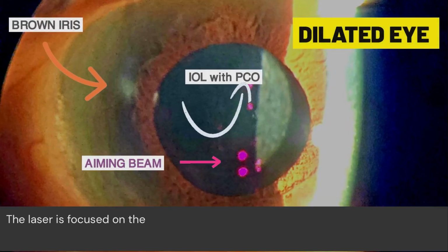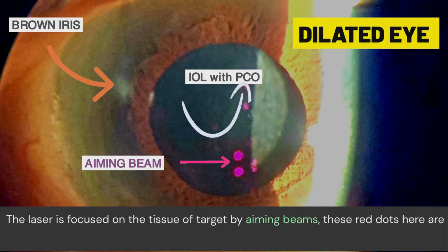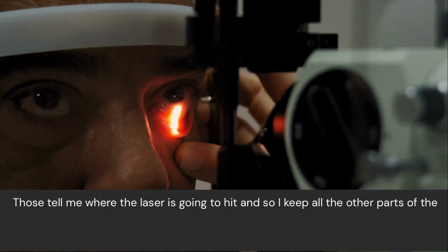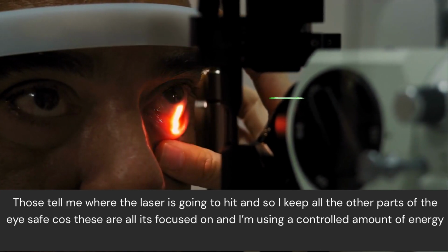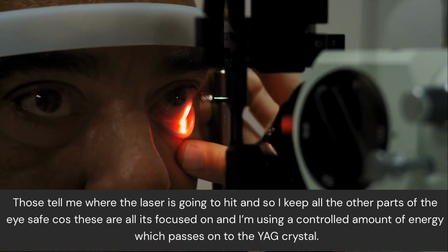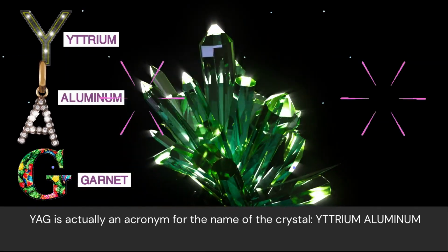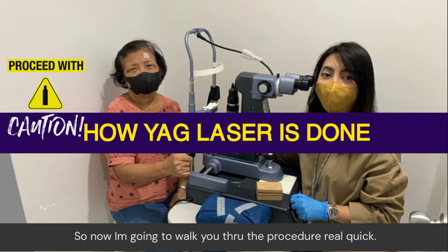Look here, this is my actual patient. The laser is focused on a target tissue by aiming beams. These red dots here are aiming beams. These red dots tell me where the laser is going to hit, and so I keep all the other parts of the eye safe because these are all focused and I'm using a controlled amount of energy which passes through the YAG crystal. By the way, YAG is an acronym for the name of the crystal, yttrium aluminum garnet. Pretty fancy, huh? So, yes, now I'm going to walk you through the procedure real quick.